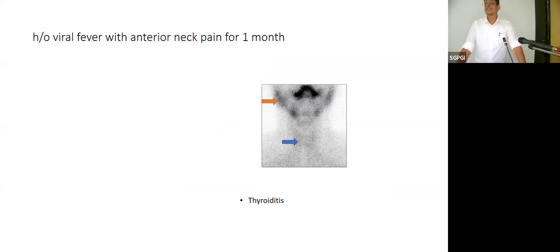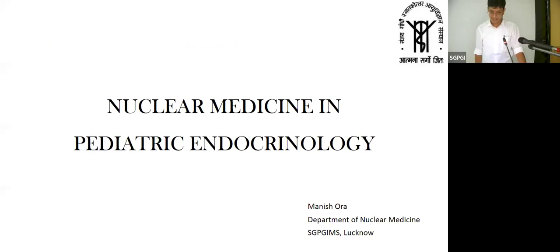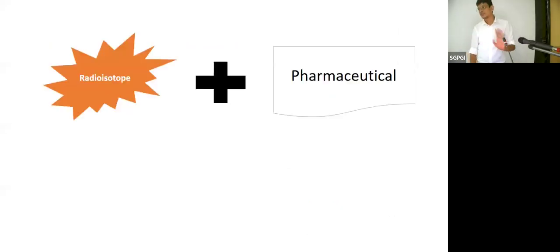So for all nuclear medicine scans, the sensitivity of every nuclear medicine physician may be around 100%, even for the FDG, but the specificity depends upon who is actually looking at it and what is the pretest probability and what are your hormone functions and everything. So I will be presenting few images only.